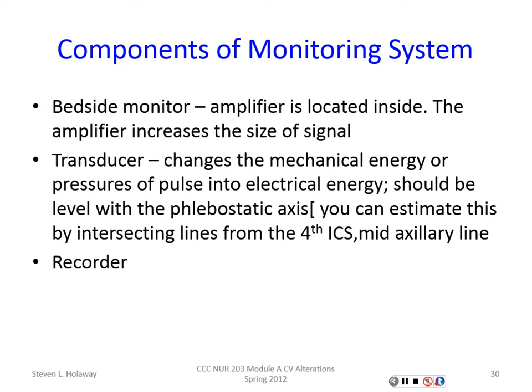What we're going to be looking at. That's the nurse's responsibility. Your responsibility will be setting up those transducers, setting up the monitor, having everything set out for that physician to do this in a sterile type process.